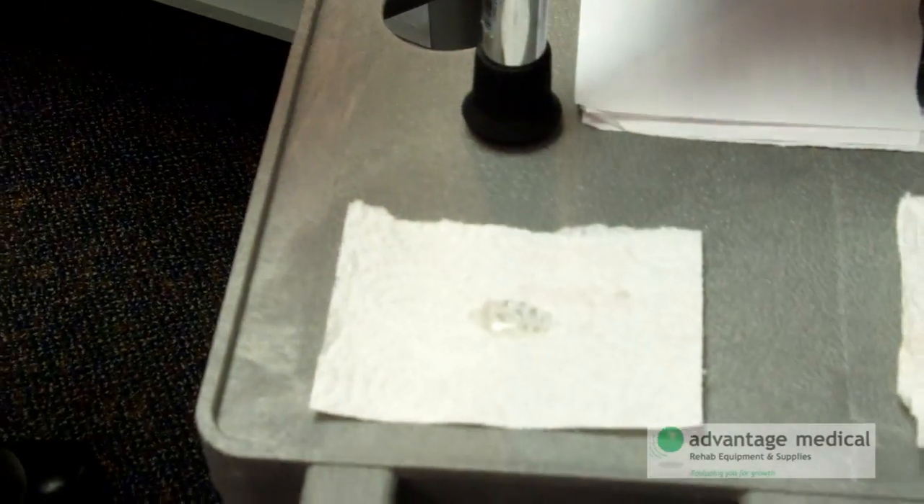Hey Joan, come on in. Did you take care of your probe? You washed it before your first use? Come on in. Let me explain how we're going to do this now. So what's going to happen is I put a little lubricant on the table here and you're going to take your probe out of the bag and just dunk the tip there.